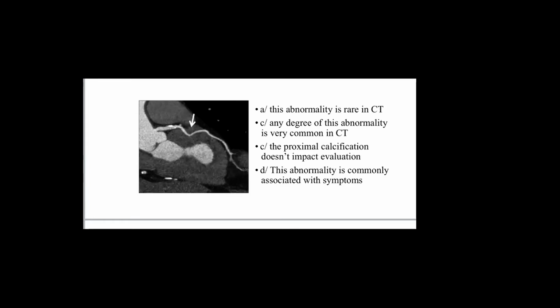According to cardiac CT, how frequently do they find bridging of any degree? Guess. I think very large, more than 50. Exactly. More than 50%. So it seems like a normal anatomical variant.